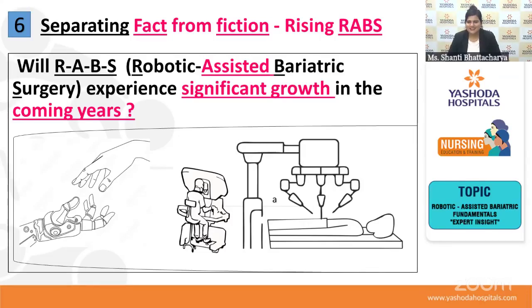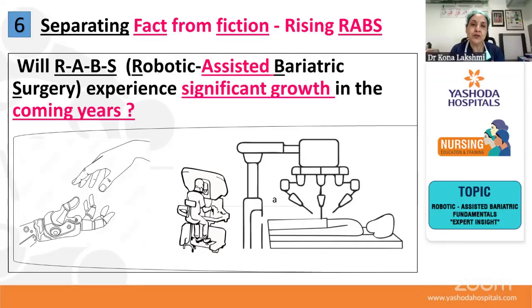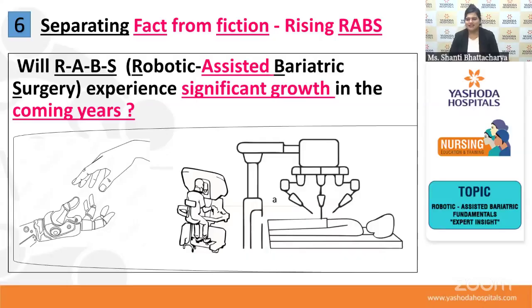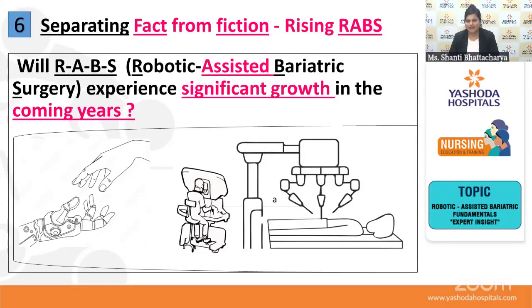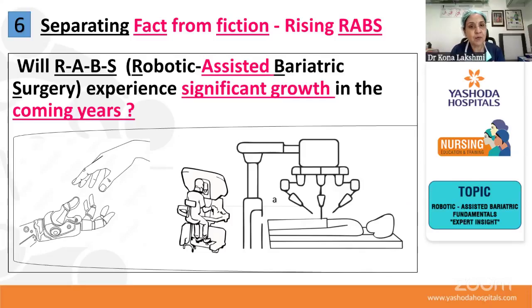Definitely you have seen two or three spoons or forks fall down from your hand, too many things in one hand. If I give you one instrument, one cutlery which can do multiple works, we would opt for that, the single item. That is the robo. So robo is the answer to the surgeon's prayers.